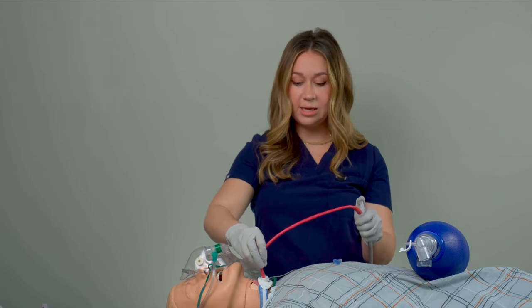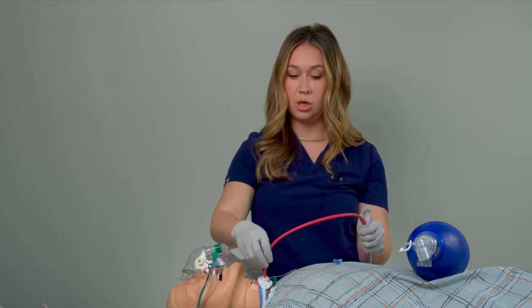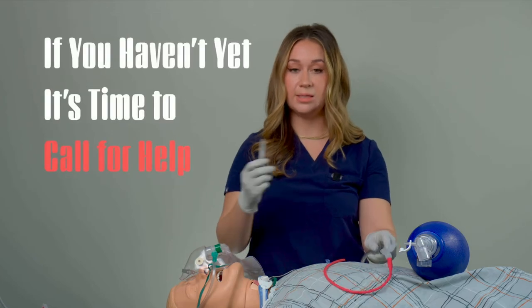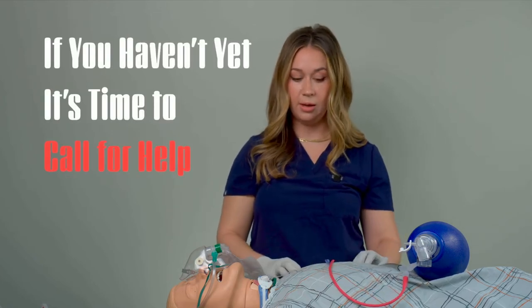If it's not easy and you're meeting a lot of resistance, then you know that there's probably an obstruction in the trach that doesn't have to do with just replacing the inner cannula, and you want to make steps towards being able to remove the tracheostomy. At this point you should call respiratory therapy and whichever medical service placed the tracheostomy in the first place, as you prepare to replace the tracheostomy.